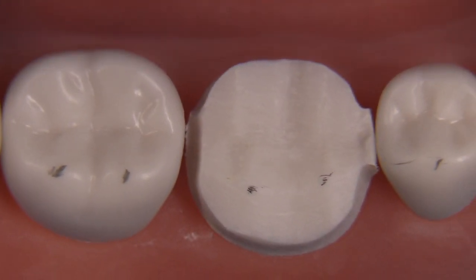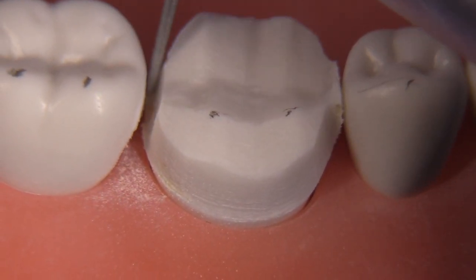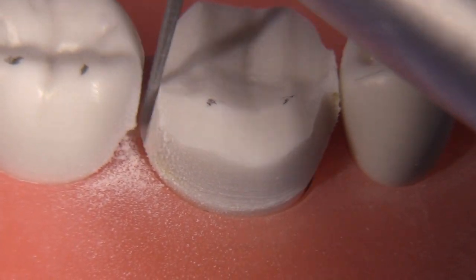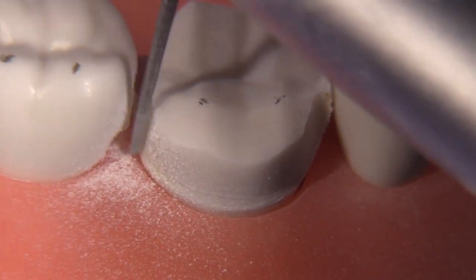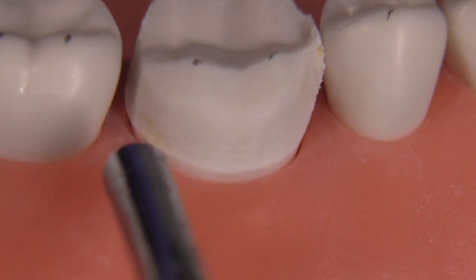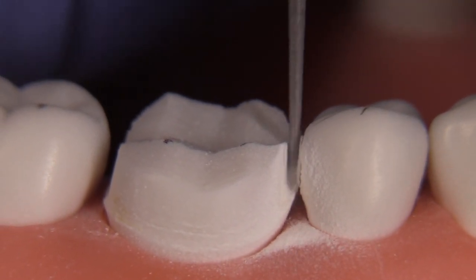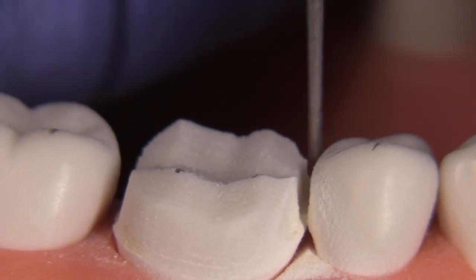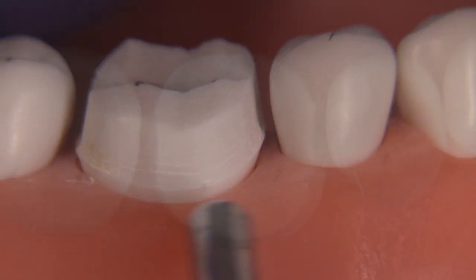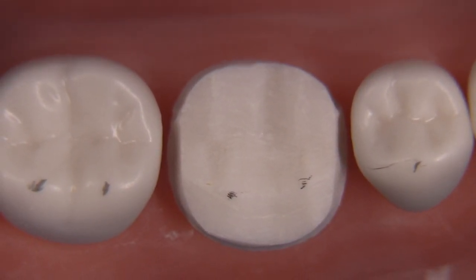Sometimes we get so worried about hitting the adjacent tooth that we tip the burr in towards the prep and over-prepare or over-taper. It's important just to think about breaking contact — your margins are going to look rough at this point. I'm just lowering it down so that we have at a minimum 0.5 millimeters of space between the preparation finish line and the adjacent tooth. This will allow scanning with an optical scanner and also allows you to place retraction cord very easily.